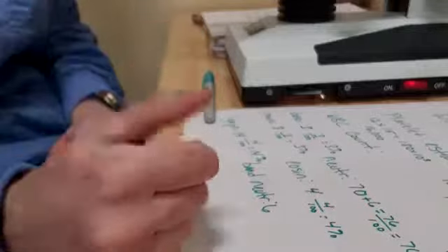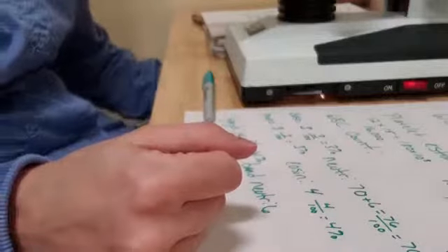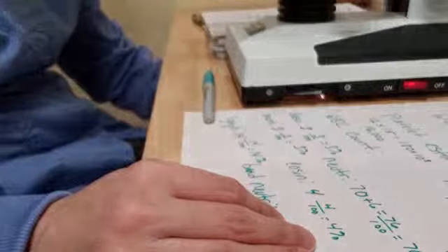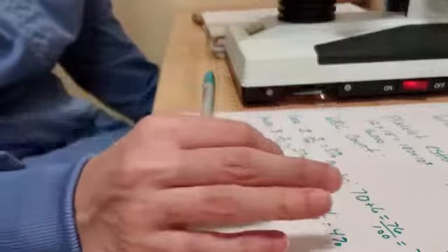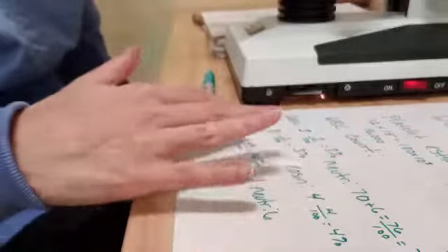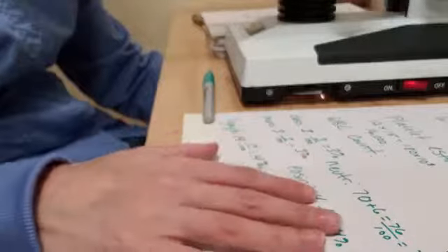So now we were also, as we were looking for any kind of abnormalities, if we did see abnormalities, we would be keeping track of that, and they would be represented in the record as if they were greater than 10 per field. So we didn't see more than 10 per field, so we wouldn't have to estimate that.